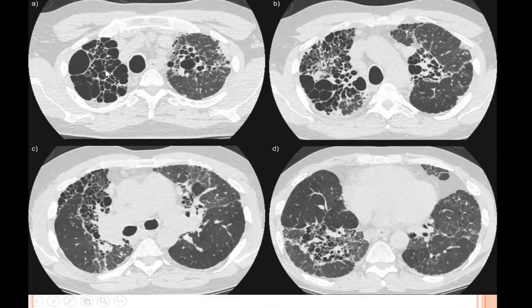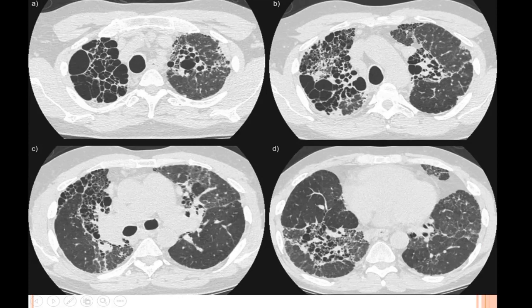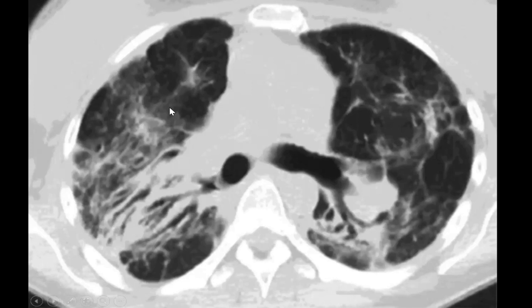This classical case of sarcoidosis shows significant destruction of the right upper lobe with honeycombing — both large and central as well as peripheral honeycomb areas. We can see peribronchovascular masses or soft tissue opacities leading to traction dilatation and irregularities, along with nodules in perilymphatic distribution — in subpleural spaces and along bronchovascular markings. The distribution shows relative sparing of the lower lobes, which is classical for sarcoidosis. Peribronchovascular masses causing deformation and angulation of the bronchi are also visible.